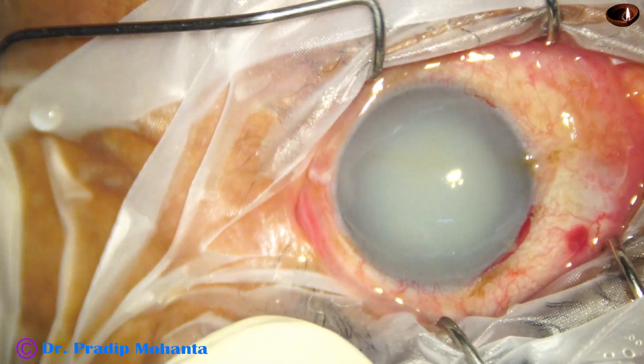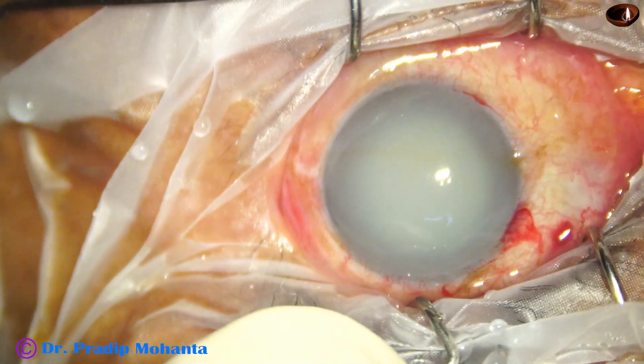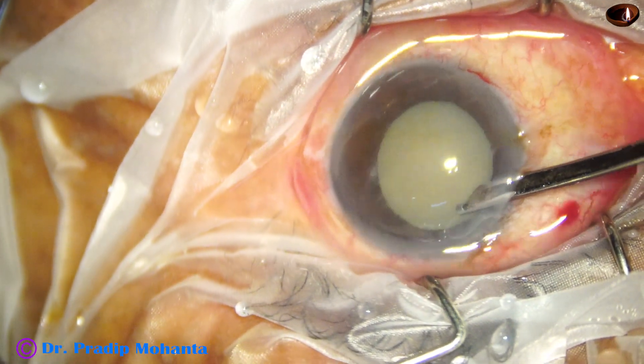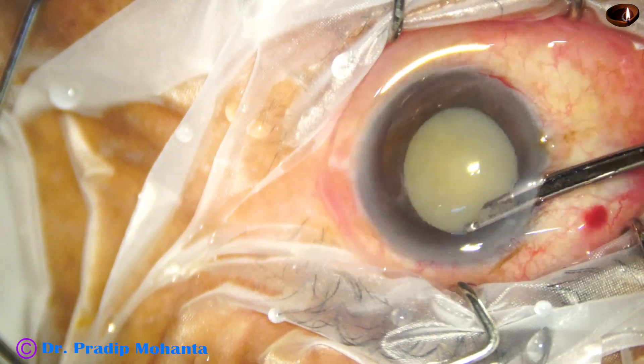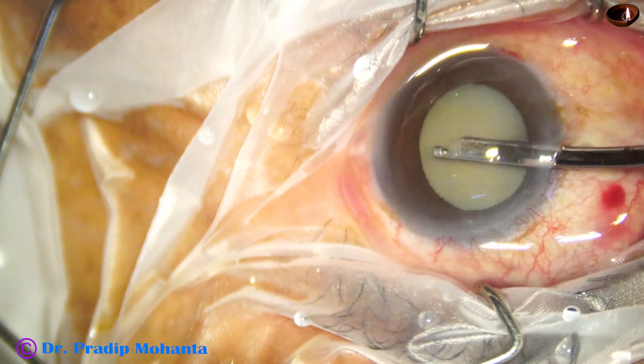Now I take a Simcoe cannula, a 23G Simcoe cannula, and wash the anterior chamber. And we can see the hypermature Morgagnian cataract and the iris details are visible now.